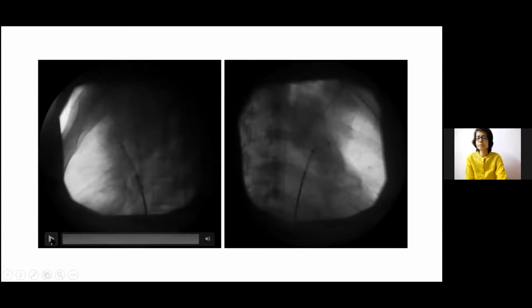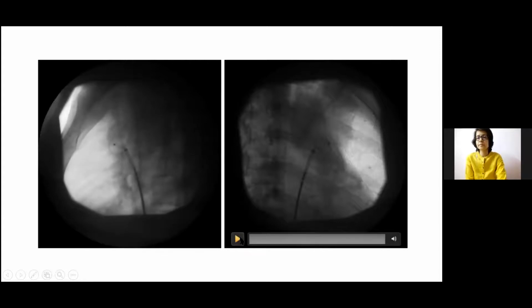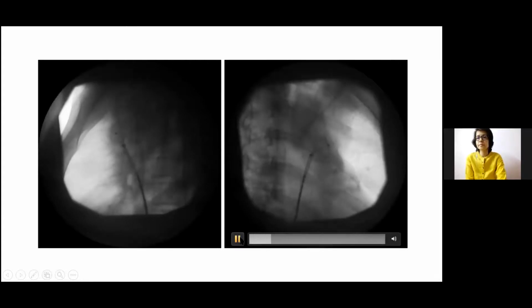Here is my colleague Debasree, who has taken the device inside, and the LA disc has been deployed inside the aneurysm. As you can see, the LA disc is gradually deployed inside the aneurysm. It is taking its own position and is abutting against the proximal wall. And after that, the RA disc is slowly getting released after the neck has been totally occluded by the part of the device.